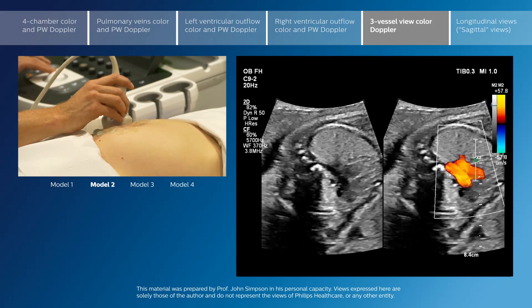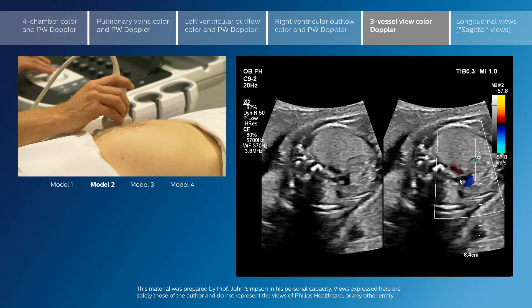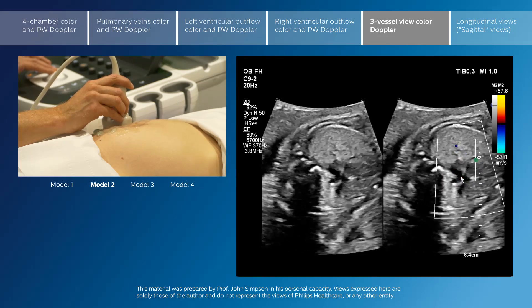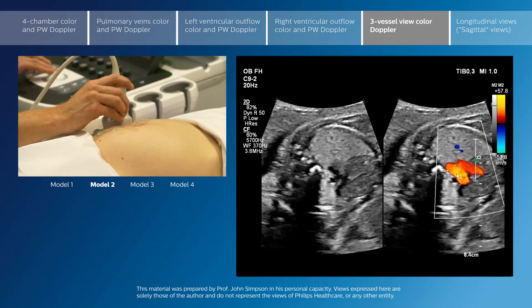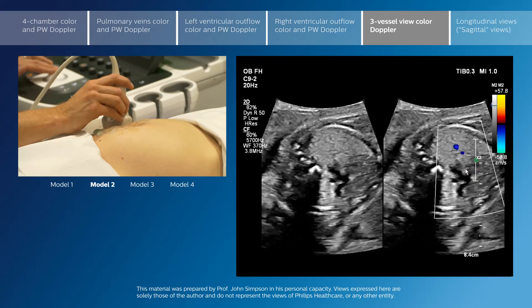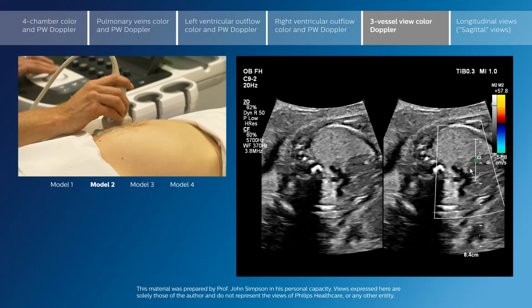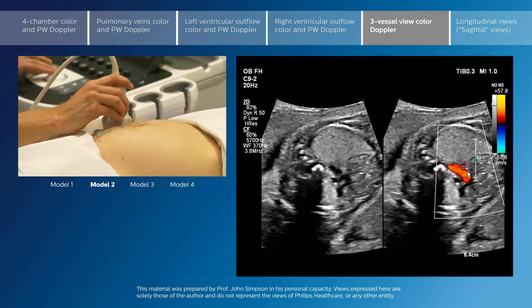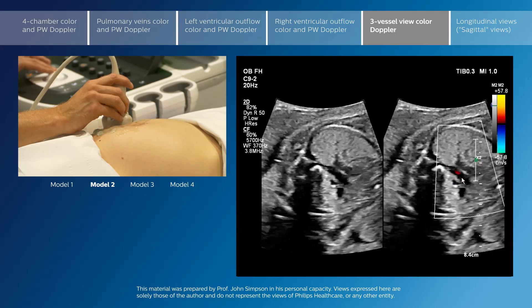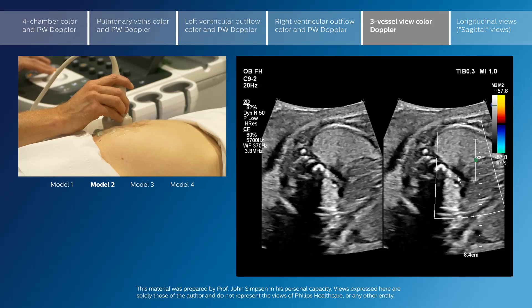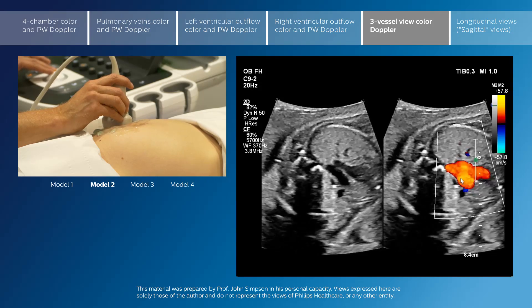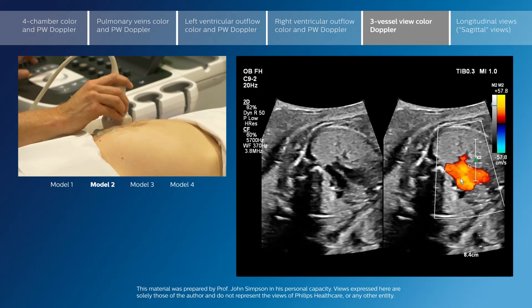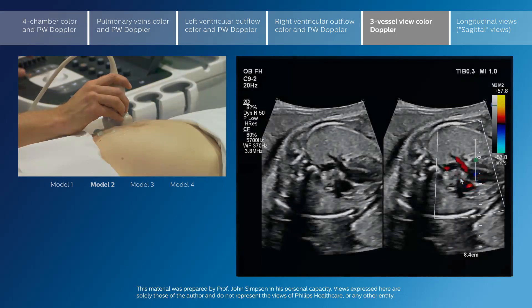As we continue superiorly, we continue to see the aortic arch but begin to lose the ductal arch, because the true aortic arch is just superior to the ductal arch.